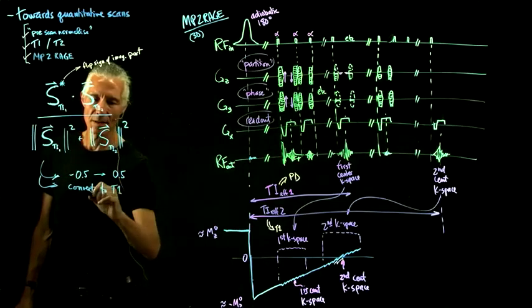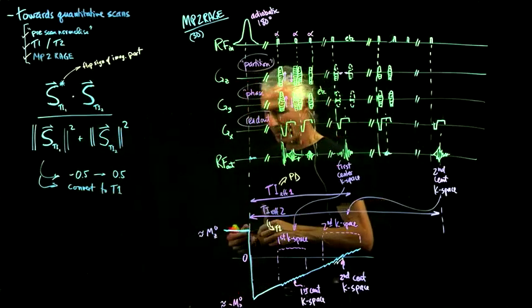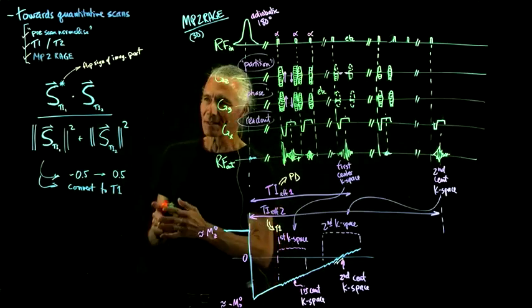So you need a little bit of extra math, but you could convert it to an actual T1. And we have this on the scanner if you want to play with this one.